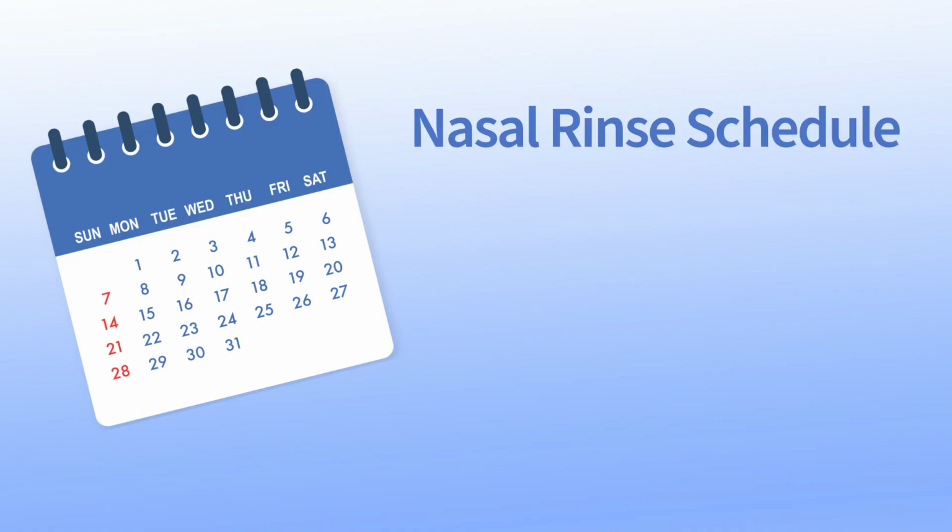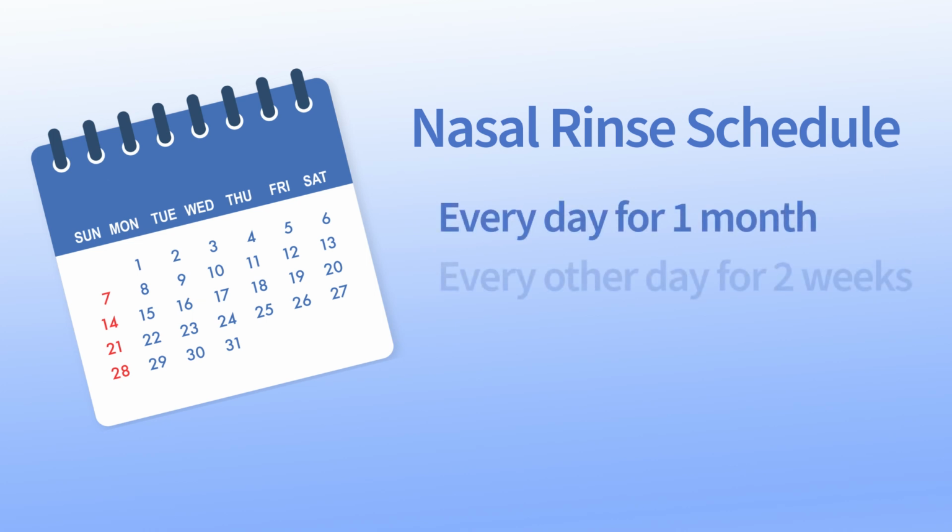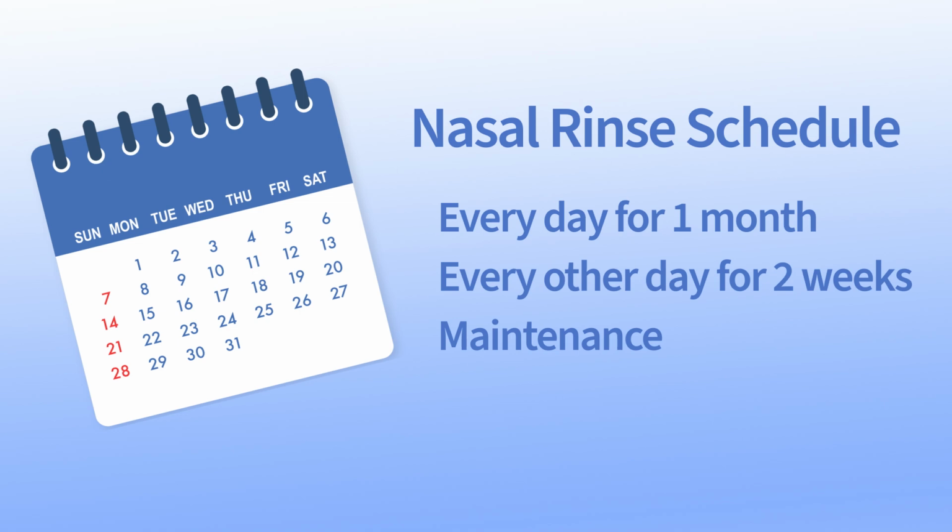I have many people who finally do the neti pot for me, and they're like, boy, I wish I would have done that 5 years ago. So the idea behind that is to keep your nose working its normal physiology, and it's not like you have to do it every day. You only have to do it every day in the beginning. So I give you a typed out worksheet, which you should have while you're watching this, and I want you to use it every day for a month. And then you can go to every other day for 2 weeks, and then you can do maintenance. So what I mean by maintenance is just once or twice a week.